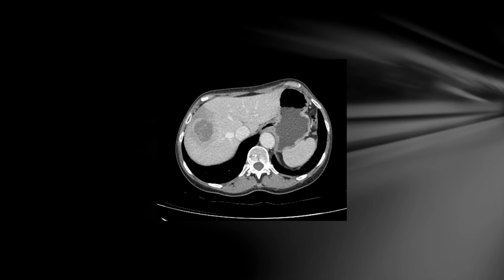Patients who present with biopsy-proven neuroendocrine tumour at sites of distant metastatic disease may also not have a primary lesion identified on conventional imaging. And identifying this primary tumour can really assist in determining both prognosis and selection of therapy.